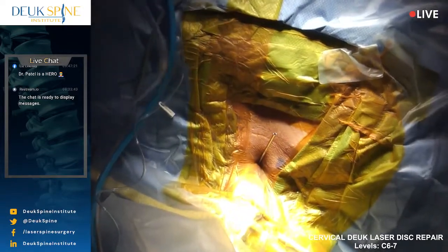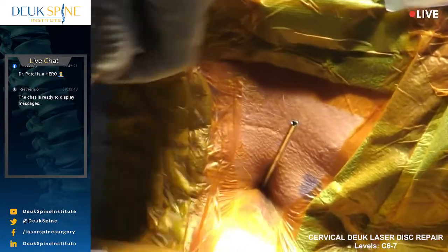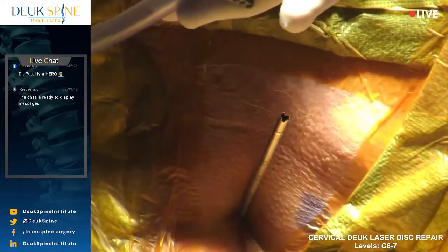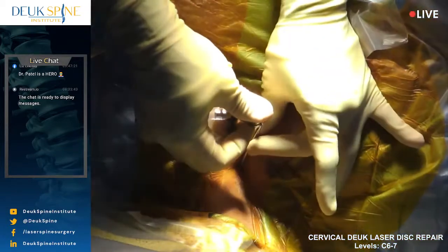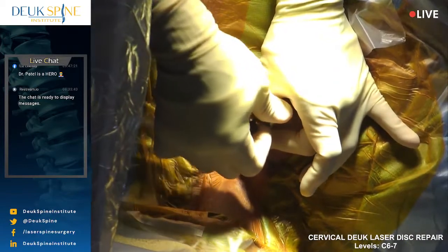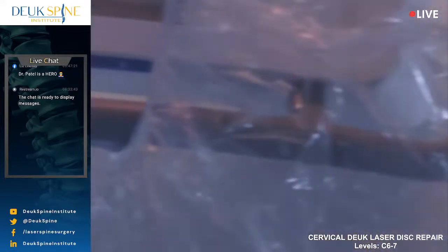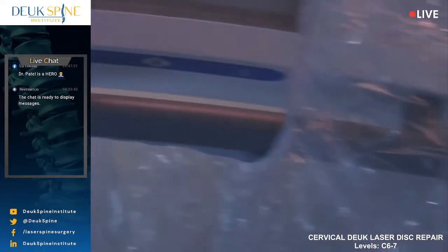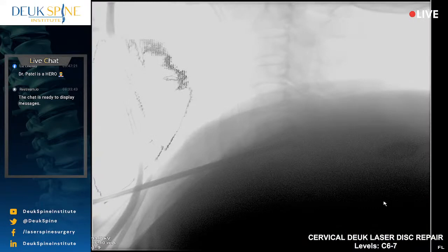Okay, we are, they say better to be lucky than good, right? We've lost half a drop of blood, half a drop. Now this patient's other option would have been an anterior cervical discectomy and fusion. He has a degenerated disc, you could see it on the MRI. He has a herniated disc, degenerated disc, spinal stenosis, pinched nerve, radiculopathy, weakness from the pinched nerve in his left arm. So we now have him asleep under general anesthesia, muscle relaxed.